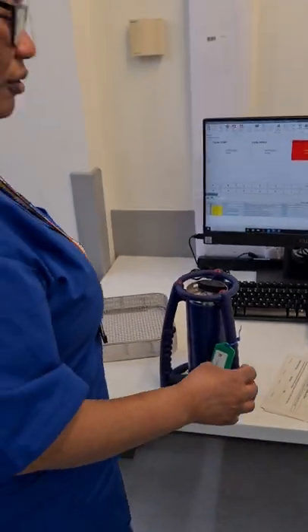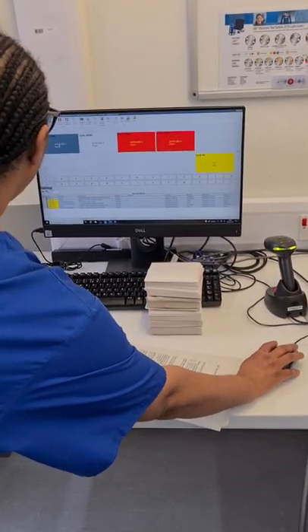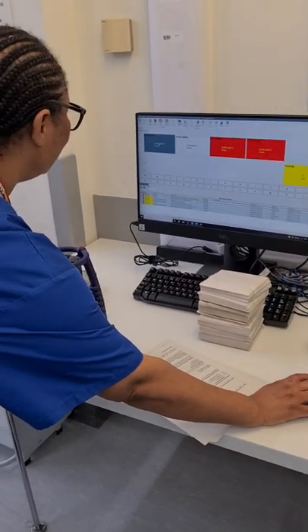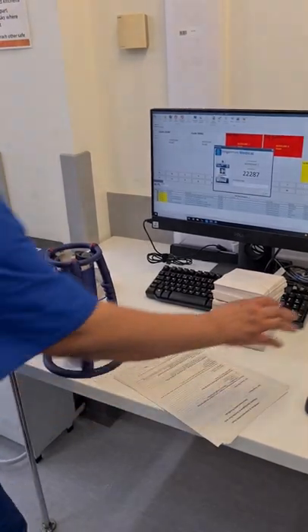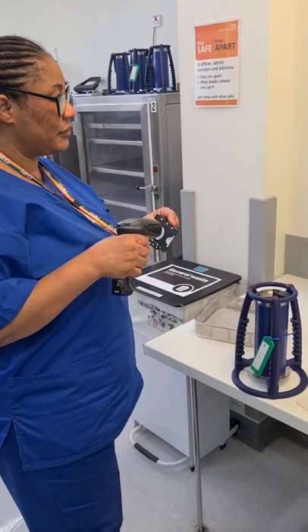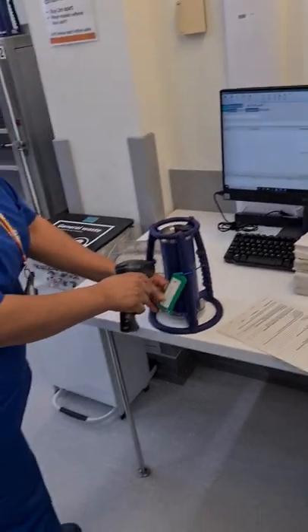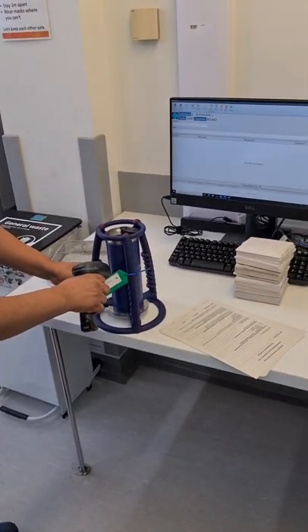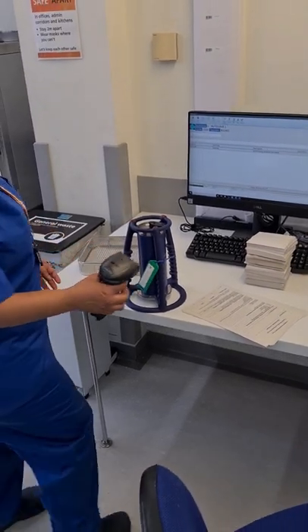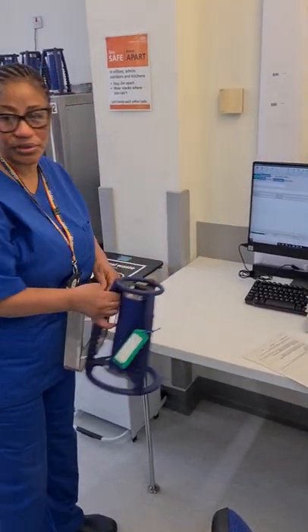Before I put it into the autoclave, I'm going to open the autoclave. I will open it and scan the ETS into the autoclave by scanning my badge as a technician, then scanning the Bowie-Dick ETS machine into the system. Once this is done, I will proceed to the autoclave.